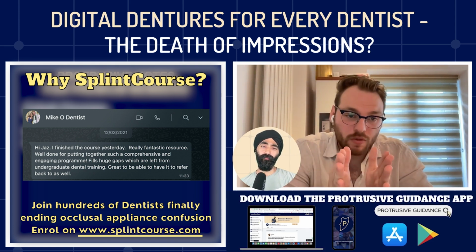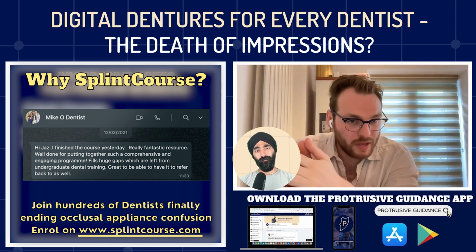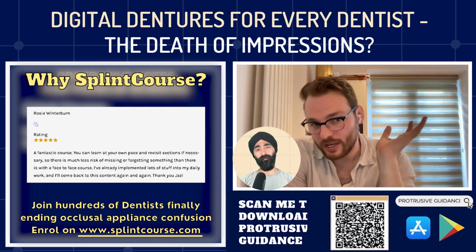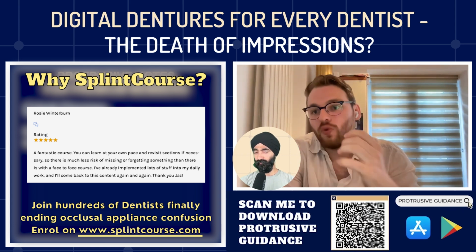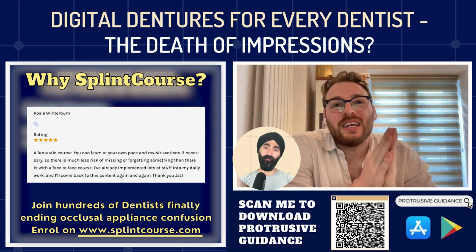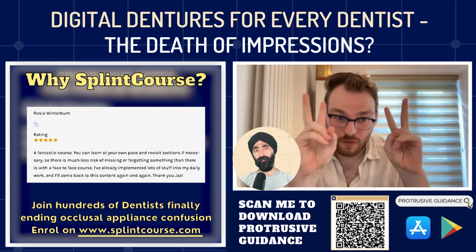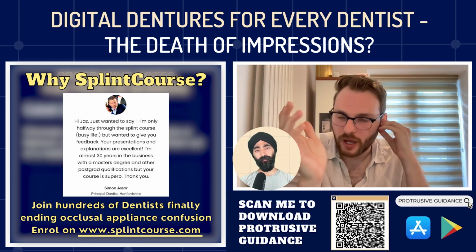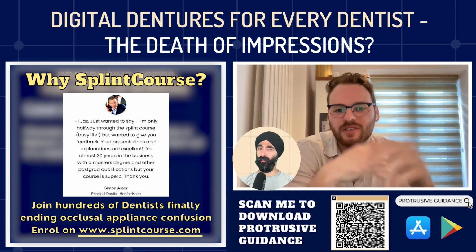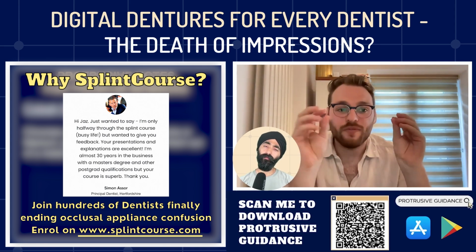If it's not an MIP, then we'll just do a conventional wax rim, because actually my lab at the moment, still with Chris Hesketh, it's all analog still from him. So he gets his printed model and he just uses that. So we still haven't dived into the digital chromes just yet. You can do them. It's the same. You can mill them or you can print them. It's not printing. It's SLM or SLS, selective laser sintering, selective laser melting. So again, you've got those two options.